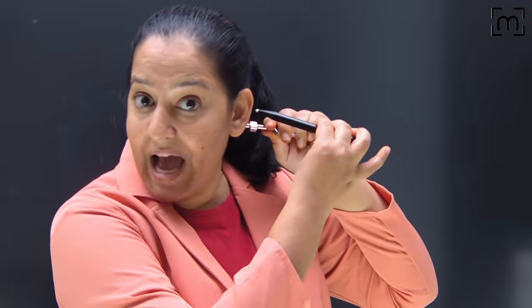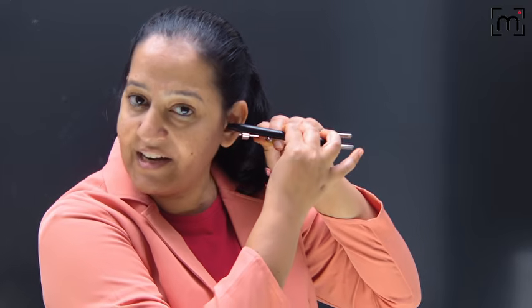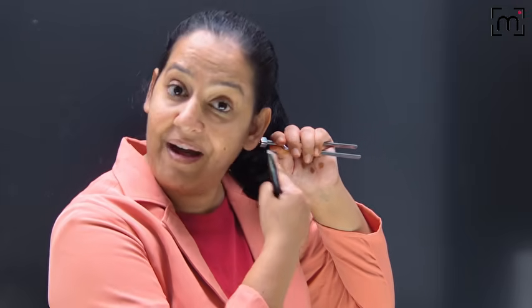I'm activating it and keeping it here. Simultaneously I'm putting the Siegel's speculum and increasing the pressure. On increasing the pressure continuously, the vibrations are same or better or worse. That's what we have to see. I hope you got it.